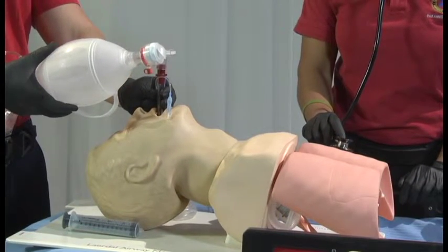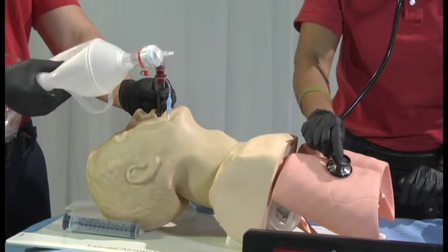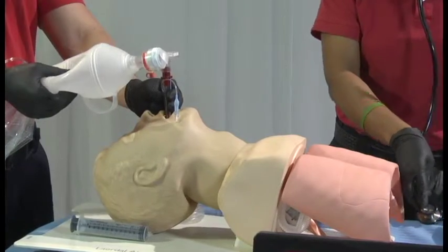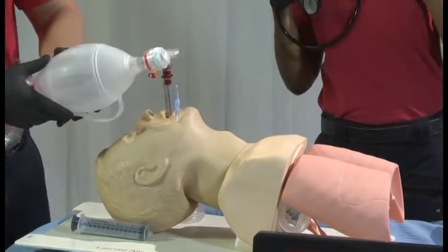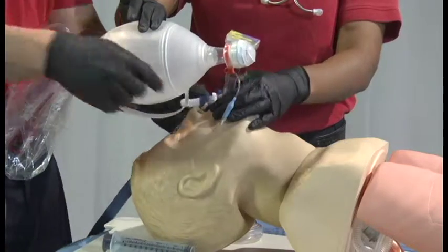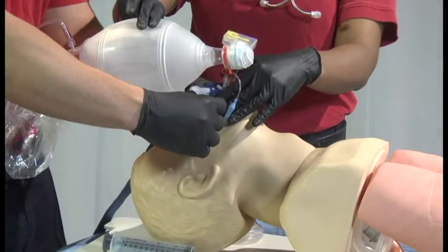Once placement has been confirmed and a waveform is noted on capnography, secure the device using tape or an approved commercial securing device. Bite blocks may be placed as well. Continue ventilation at the appropriate rate and volume.